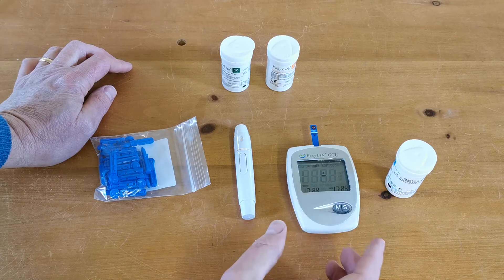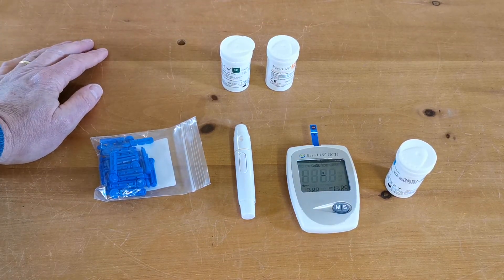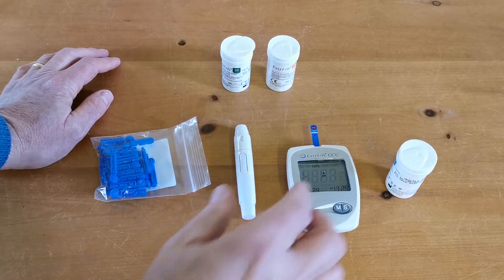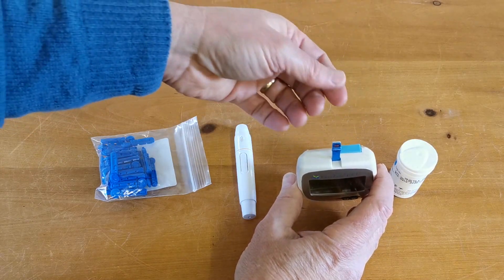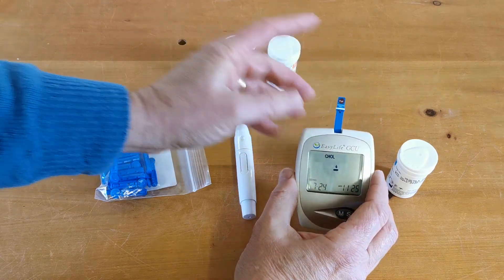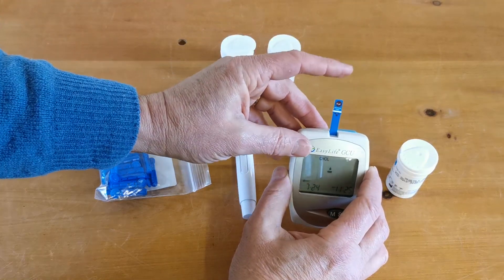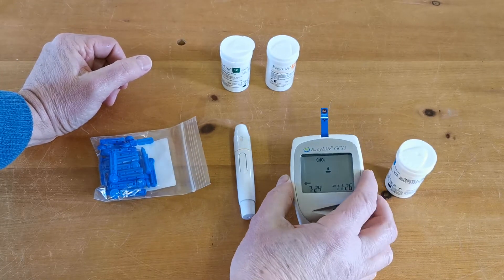A little bit of information: because this meter takes three different types of test strips, we're often asked whether it's necessary to have the corresponding code chip for the right test inserted. The answer is no — once the calibration has been applied you can run a test without the code chip in, but it is necessary the first time so the calibration is transferred into the electronics and stored within the meter.